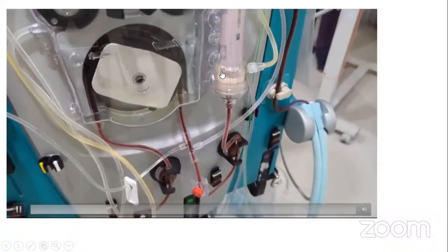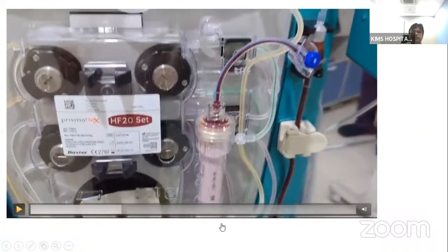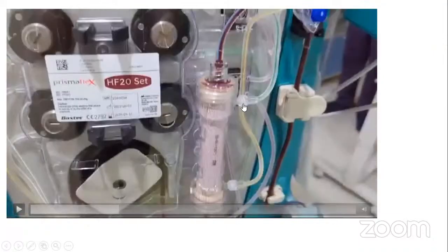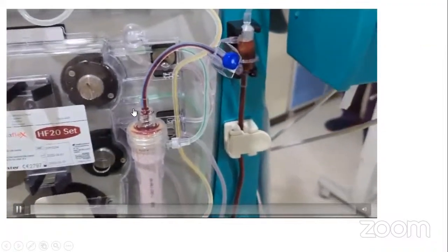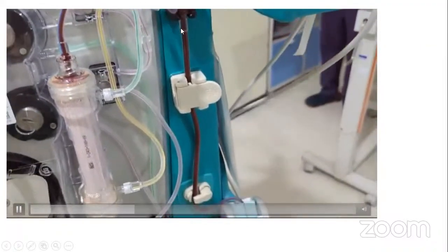Once the blood passes through the filter, this is where the effluent comes out. After the effluent is removed, the blood goes on.